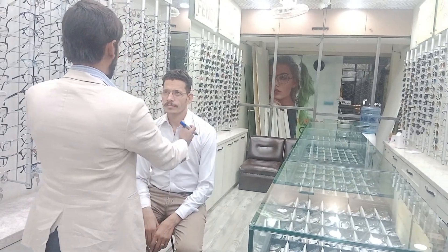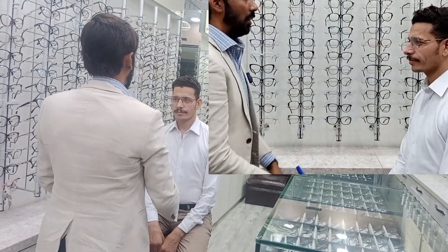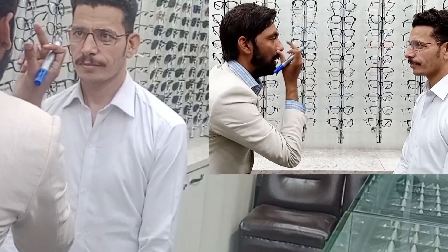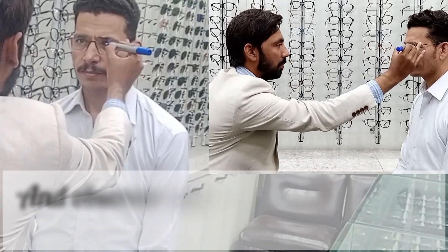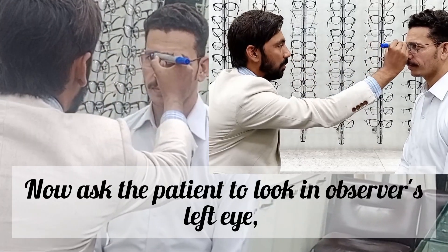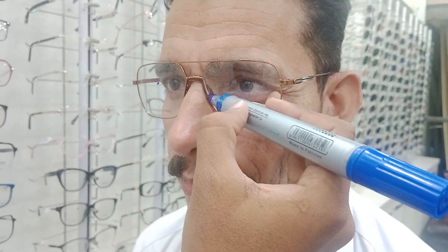Now we will take the measurements. The eye level should be the same — your eye level and your patient's eye level should be the same. Your patient will look in your right eye and you will mark their left eye, and your patient will look at your left eye and you will mark their right eye. Now we will mark the segment height exactly at the level of the lower eyelid.